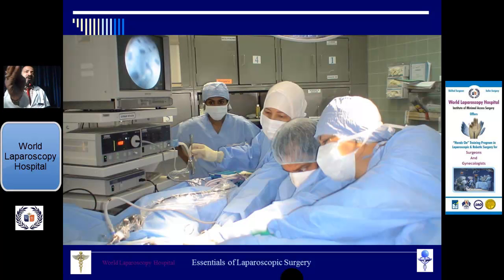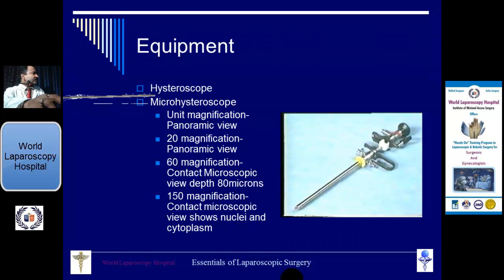In a small gauze piece you can put misoprostol 2 tablets with moist saline, and then, especially in nulliparous women, there will be softening of the cervix, that will help you to introduce it safely. You may not need to dilate it also. In multipara it is not necessary, because anyway you can introduce it much better.